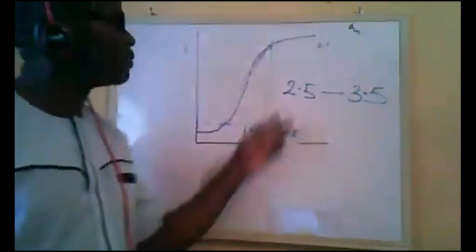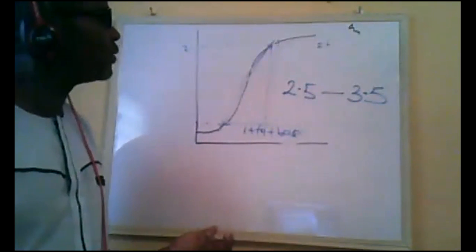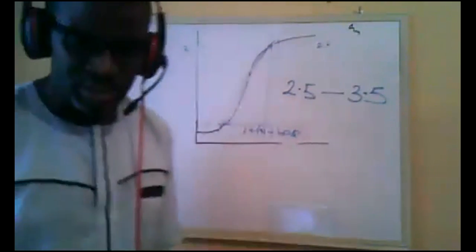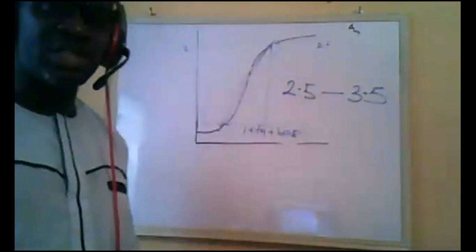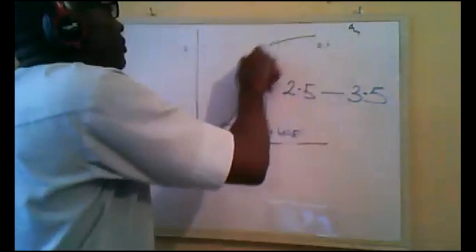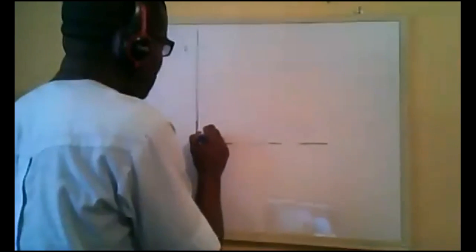So this is one of the points we can draw from an HD curve, as we can use it to find the contrast of a film. The contrast of a film, we said, is simply the slope of the curve. If you have two HD curves that have different slopes, it means they have different contrasts. Let me have you two curves on this same axis. You have one.